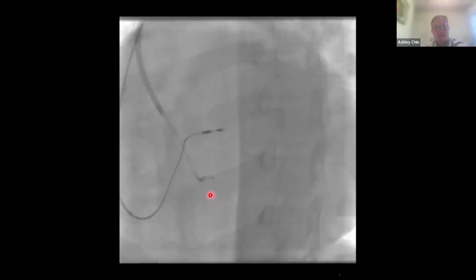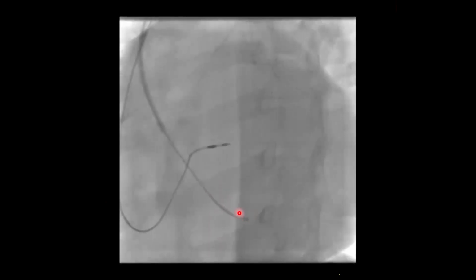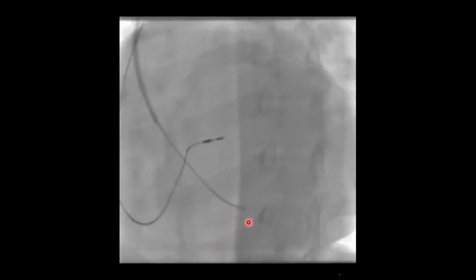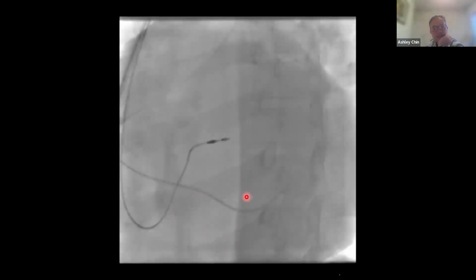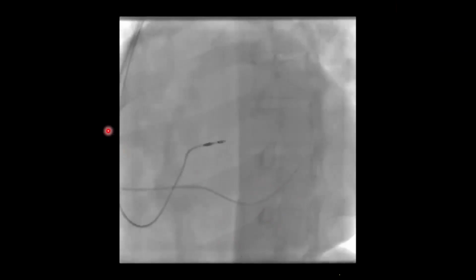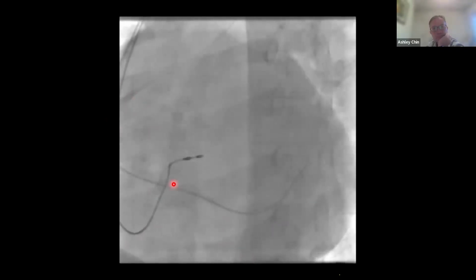Okay, so here's the AL1 catheter again. It slipped quite nicely in using a wire. As soon as the wire's in now, you can advance that inner diagnostic catheter forward, and then over that you can advance your sheath. So this is one option that you can use.